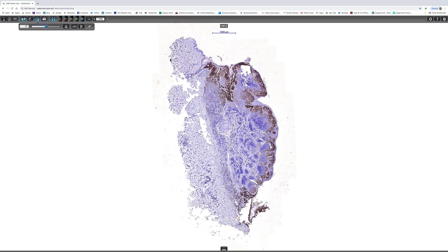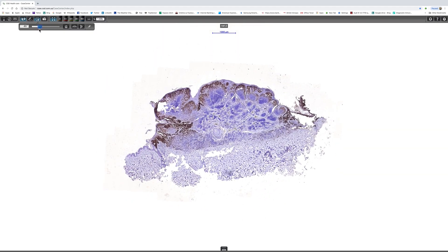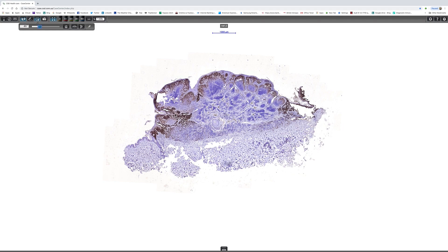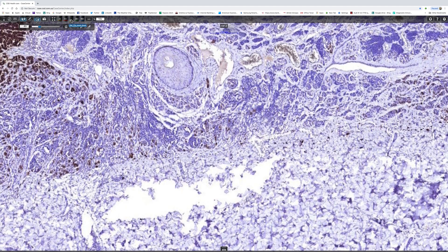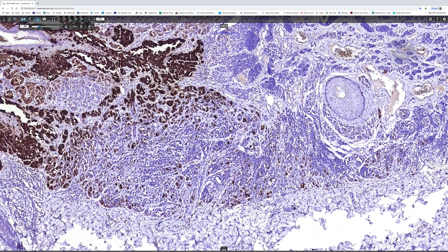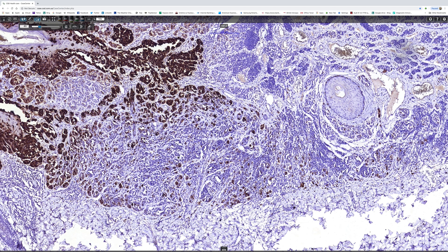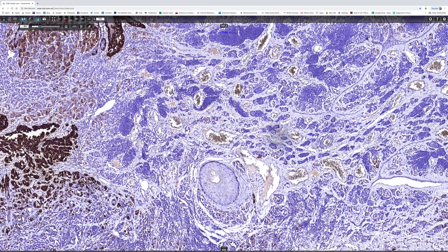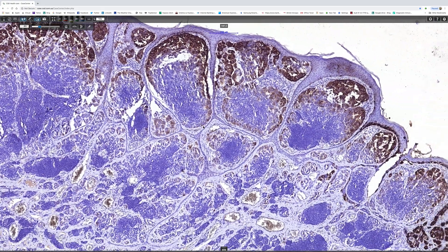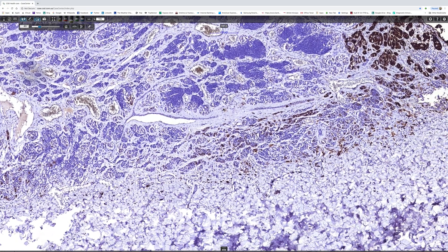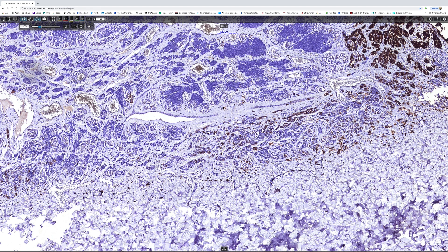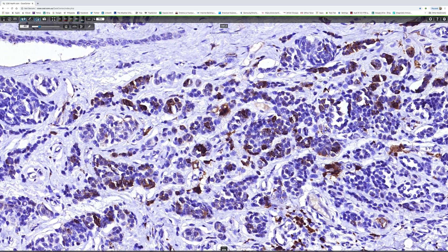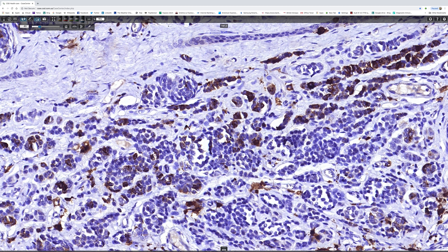On the HMB45 slide, you can see this very striking expression and labeling of the melanoma, whereas the nevus is completely negative. At higher power, the melanoma is strikingly positive and the nevus cells are totally negative. Moving around the slide, all the nevus is negative while the melanoma is positive. Down at the bottom of the lesion, the nevus is negative and the melanoma at the bottom is positive — quite useful.